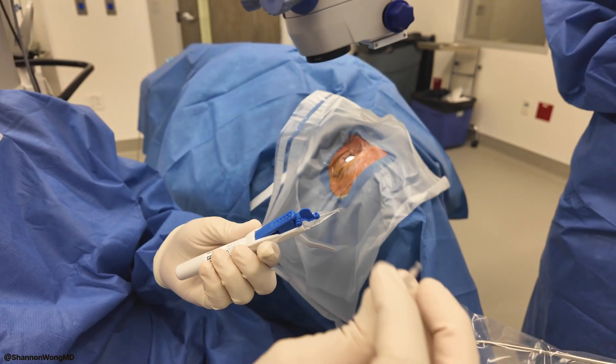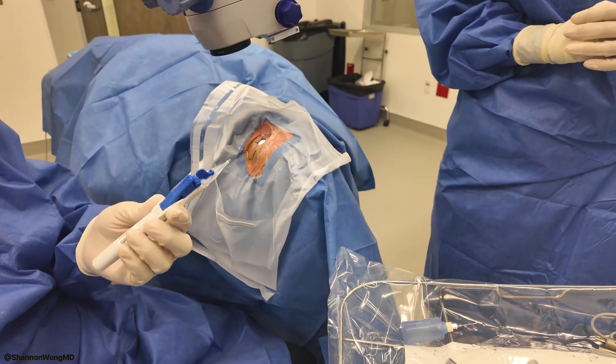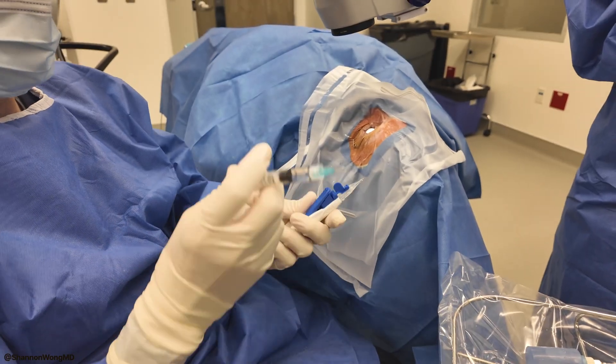So this is the amount of consumable that goes in with a normal Panoptix — this is reusable. This is CO2. Plastic, plastic, plastic. And let's use it.